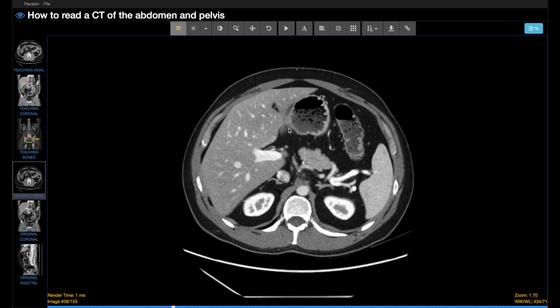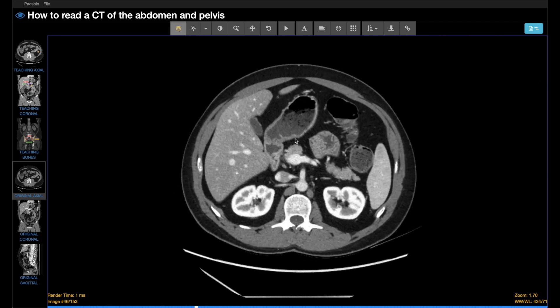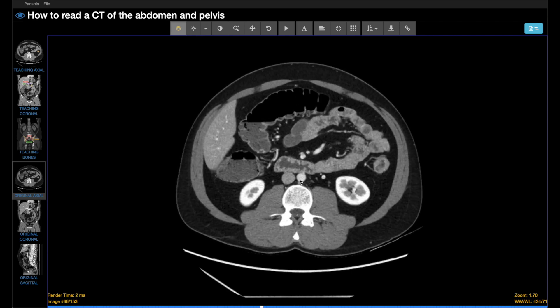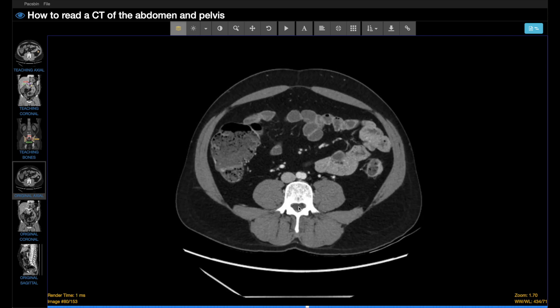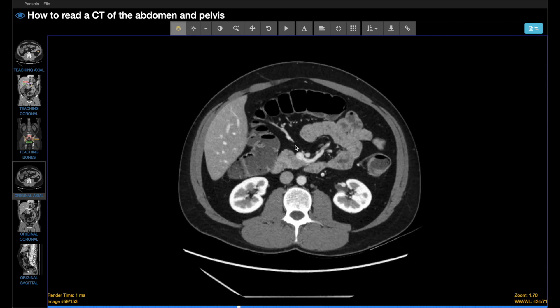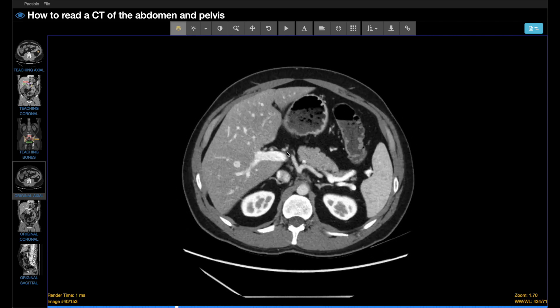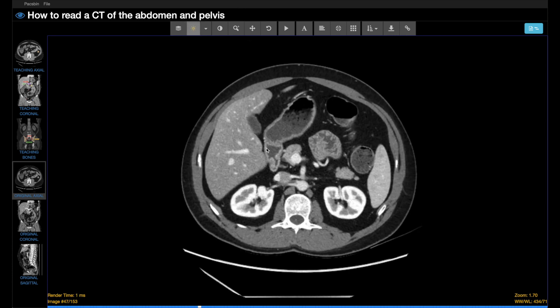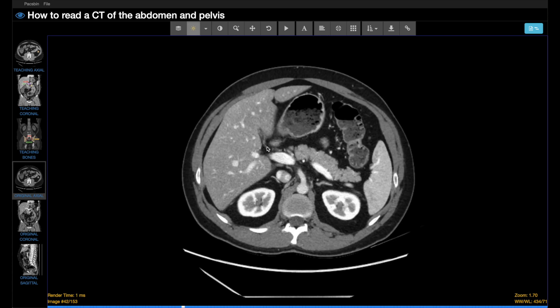The scroll stack feature allows you to hold the left click down and smoothly scroll through the study, which can be less fatiguing. The adjustment of window level settings is a very important thing to be familiar with.